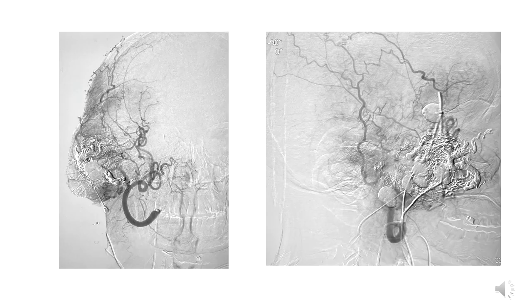DSA, just to check that we have not caused any harm, and we still see that the core of the tumor is embolized and the large part of the surrounding areas and the superior part of the tumor is still unembolized and filling. So now, because we are unable to get any nice vessel visualization on direct puncture, we switch over to transarterial microcatheterization and embolization with particles or glue or coils, whichever we deem feasible.